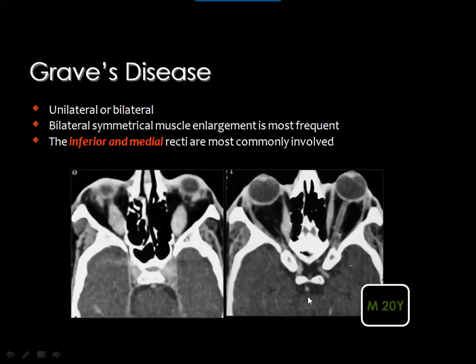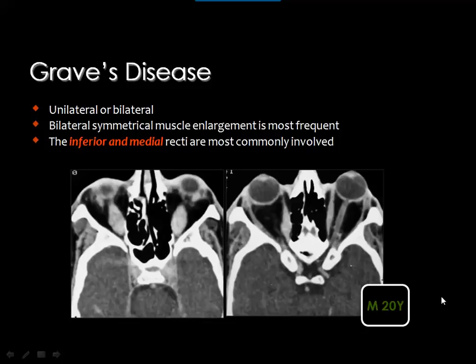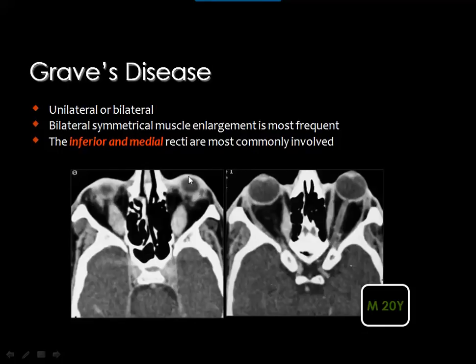Graves' disease is a metabolic disease usually associated with thyroid abnormalities. It causes deposition of mucopolysaccharide protein complex within the muscles and fat, resulting in almost symmetrical enlargement of multiple extraocular muscles unilaterally or bilaterally, together with infiltration of the intraorbital fat. This leads to enlargement of the orbital volume and consequently bilateral almost symmetrical proptosis. The most commonly affected muscles are the inferior rectus and the medial rectus.